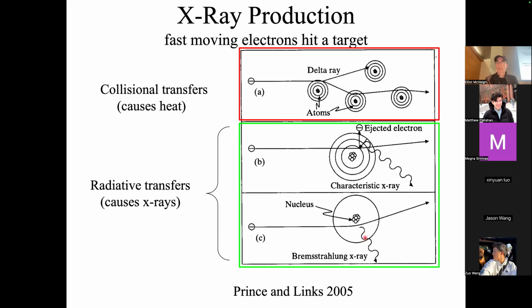So when you add up the energy of this X-ray and this electron that had this glancing blow, it is the energy it started out with. But what we've generated is an X-ray, right? So that's how the X-ray got generated. And most of the X-rays we're going to use in the patient are generated this way. It's called Bremsstrahlung X-rays.